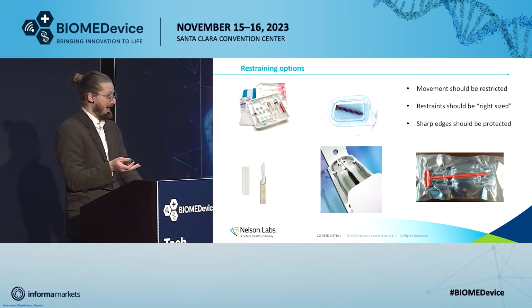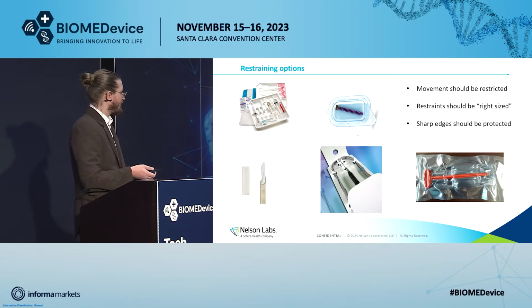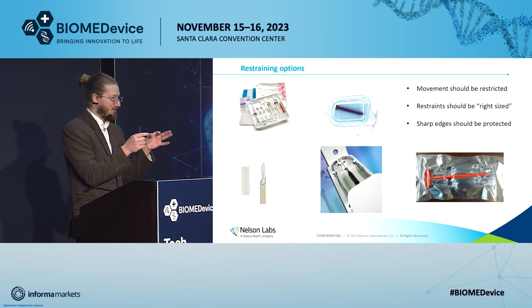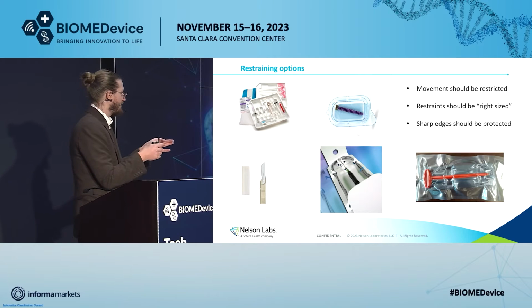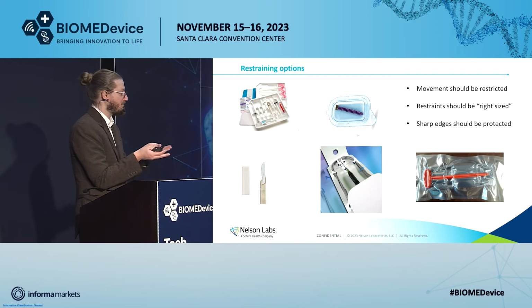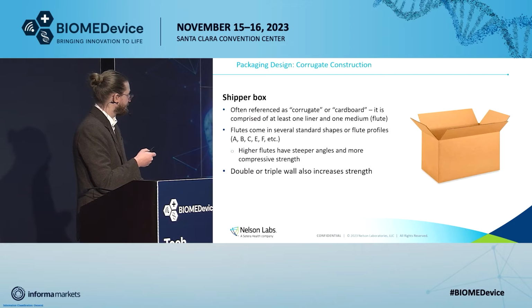So if you have something that has some of those components in there, right? Like if you have sharps that you need to restrain, there are lots of options that you can choose. If you look at the screw in the top center there, that's a pretty common thing that we see, picking something that will keep it in place and prevent it from rubbing against that sterile barrier. Just below it, you can have these cardboard inserts that'll restrain your device and make sure they aren't jostling, moving around, and causing those failures too.